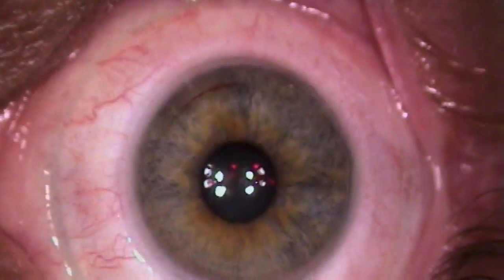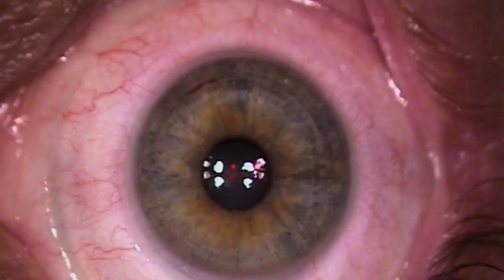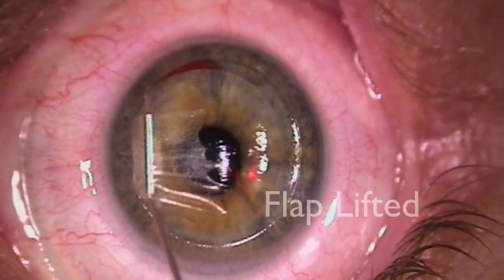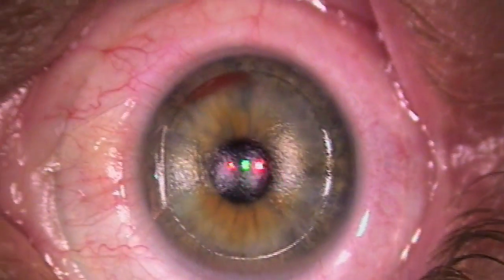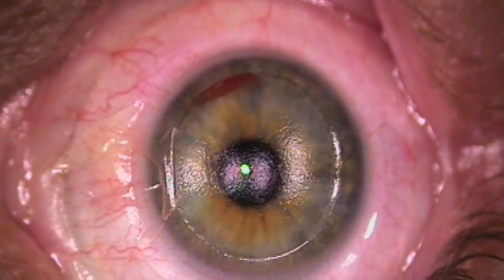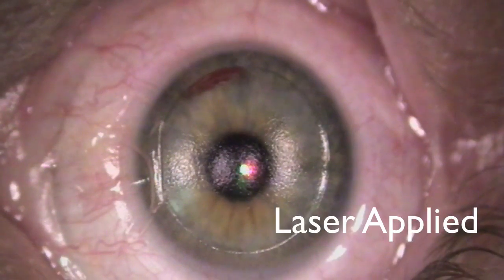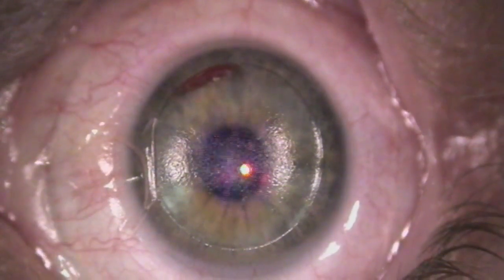What I'm going to do is make the green light get bigger and blurry — notice how it just got big and blurry? Let's turn the lights down so you can see a little better. Just kind of listen to the clicking noise. You're doing great.